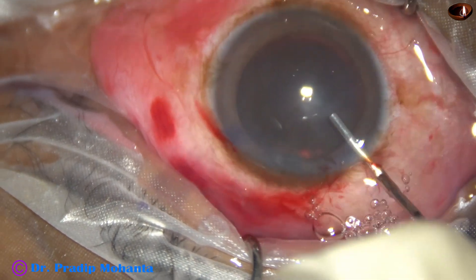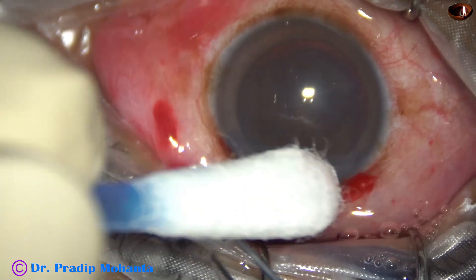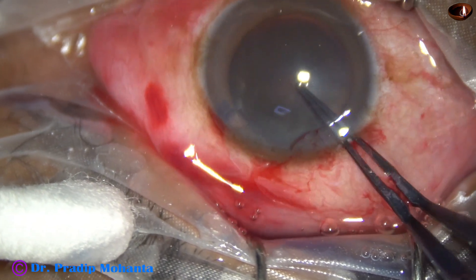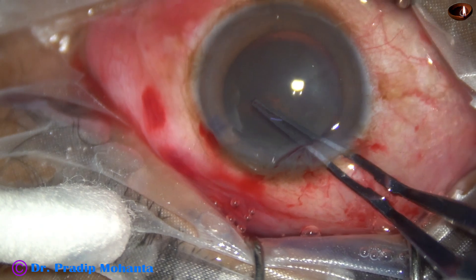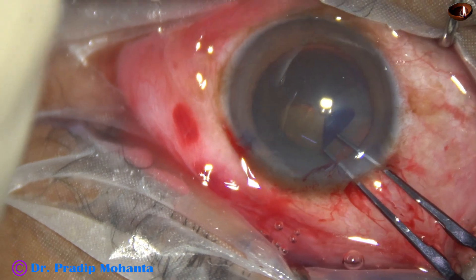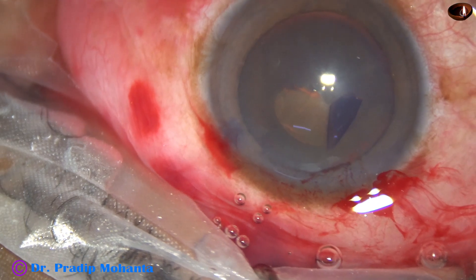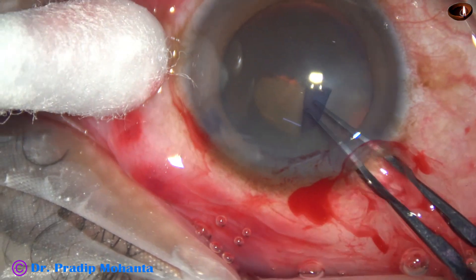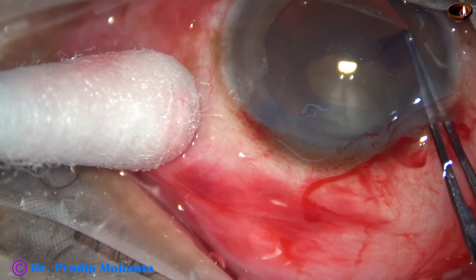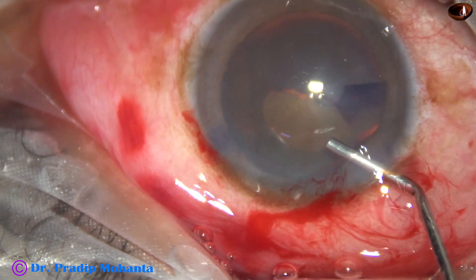The anterior chamber is filled up with viscoelastic and now capsulorrhexis is to be done. As I try to make a puncture on the anterior capsule, the whole nucleus moves. This indicates weak zonules. In this case, I am thinking of supporting the lens mass with a hook and then doing the rhexis.